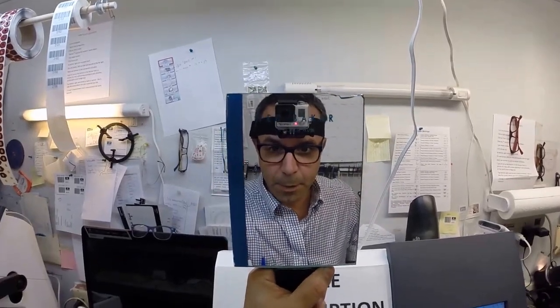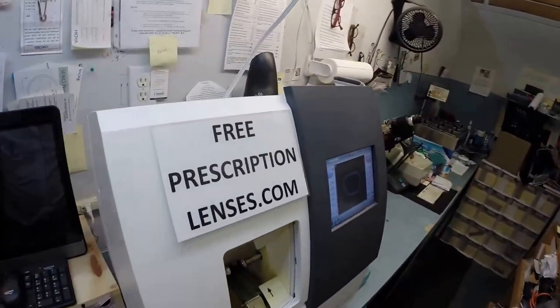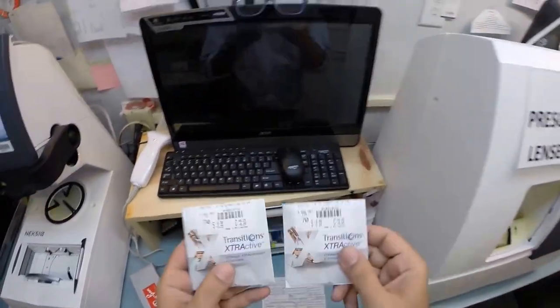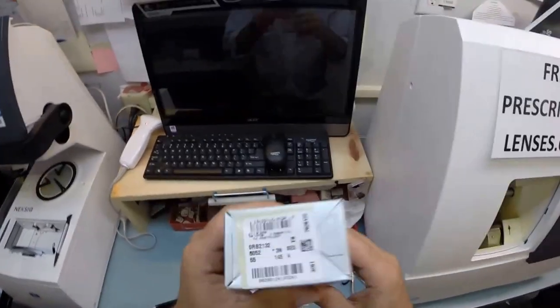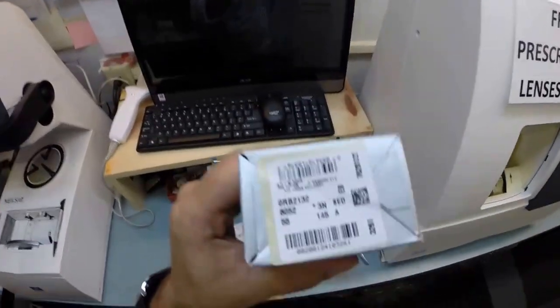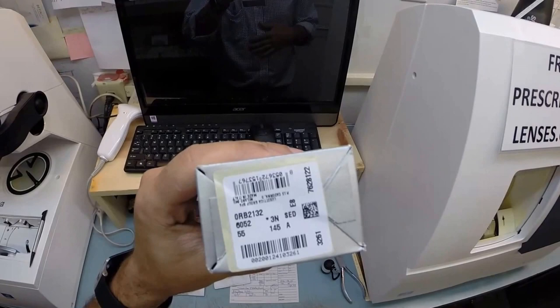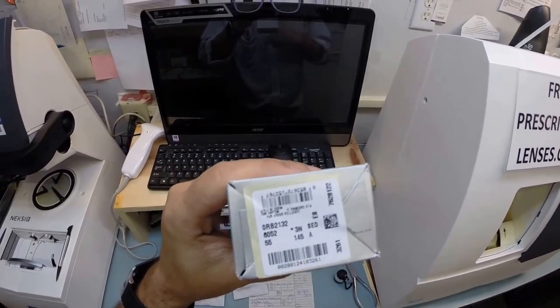Hey Eric in Kellogg, Idaho. Matthew here with FreePrescriptionLenses.com and with the help of my GoPro camera I'm going to show you how I cut transitions extra active for your Ray-Ban 2132 new Wayfarer color 6052, which is the black crystal in the 55 eye size.